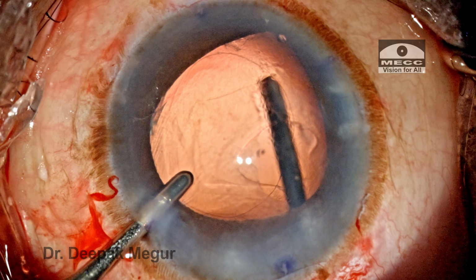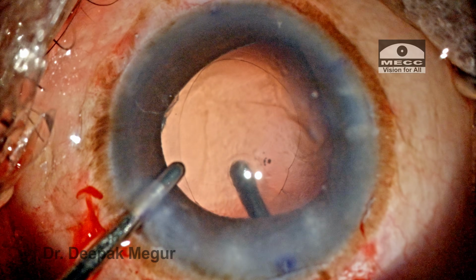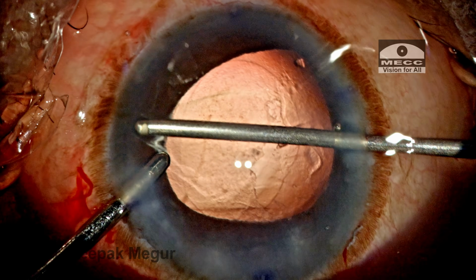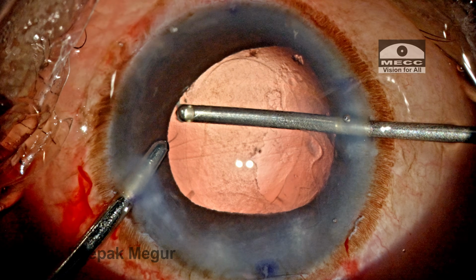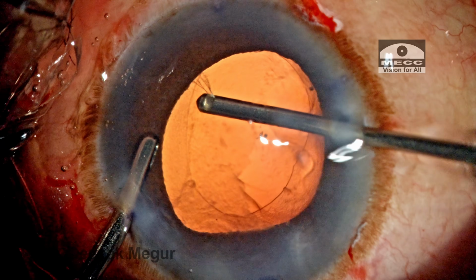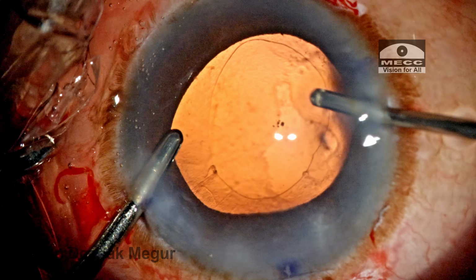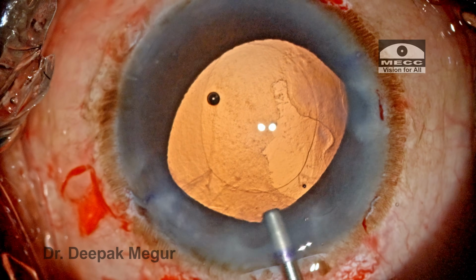In a few minutes, the vitreous which had prolapsed out through the zonules is pulled down, cut and aspirated. However, there is still some amount of transzonular vitreous coming from another area which needs to be dealt with. This is dealt with the anterior translimbal approach. After some time, I can confirm that there is no more vitreous in the anterior chamber. Time to implant the lens.